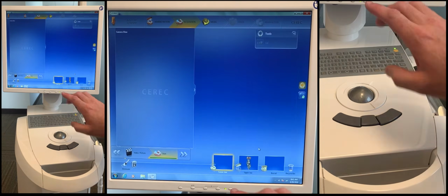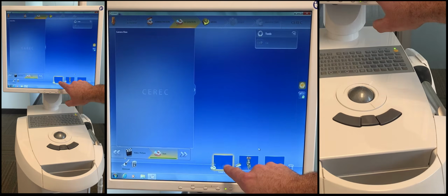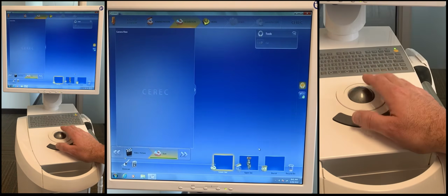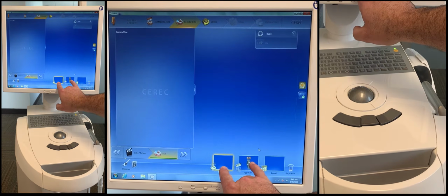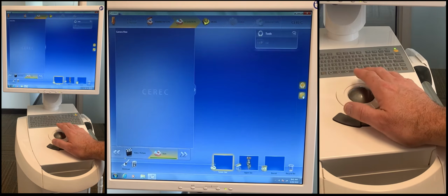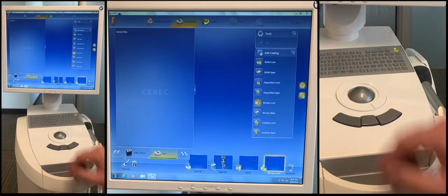Now, one thing that sometimes happens is if you get all three of these boxes filled and you've got these two in the wrong location. Well, how do we deal with that? Well, there's this button over here that will allow you to add a folder. And if you do need to move them around, and this is maybe going a little bit off the tracks, you can add any of these. So let's just say we want to add that one.